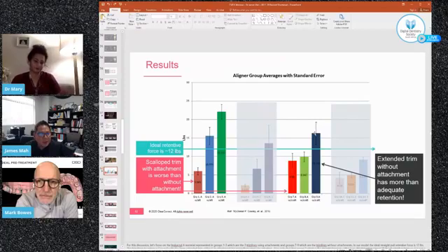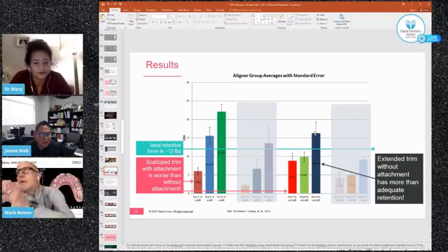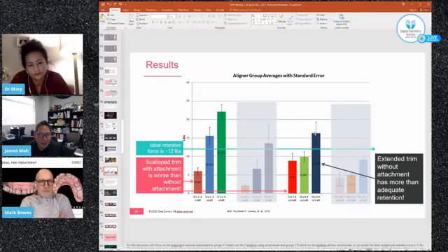And you might ask at this point, what's the big deal about retention? The big deal is for aligners to work, they need to be seated. They need to be retained on the teeth. And just like the fixed appliances, if the wire is outside the bracket slot, you're not going to get what you want. So retention is the name of the game here, to allow the plastic to work and allow the teeth to move.